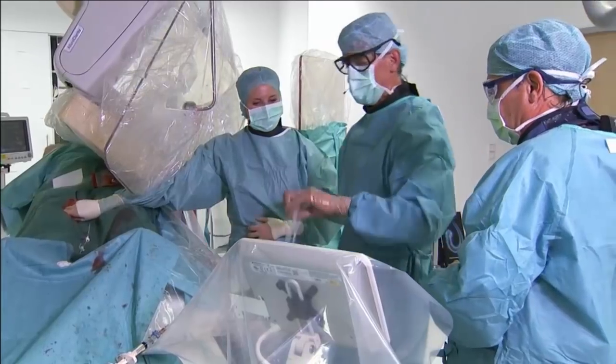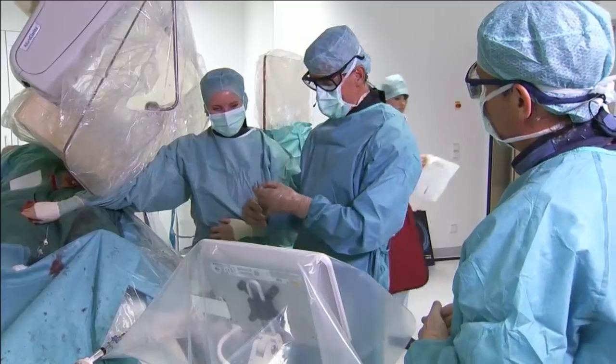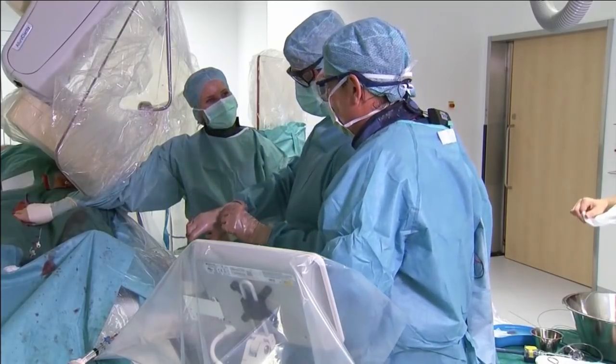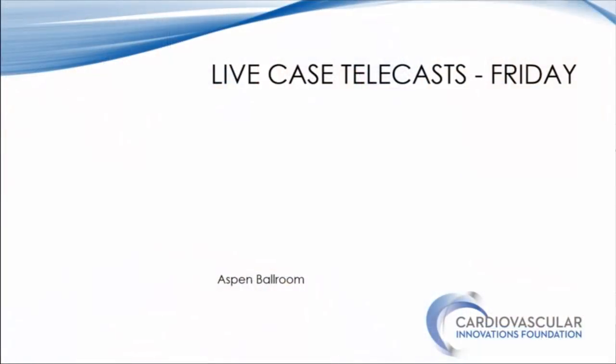I think what was interesting through all these cases is that there are multiple things to learn from Andrej, not just the crossing. Every step and every technique he uses are so clearly deliberated. Mehdi, please. I think the thing that you learn the most about him is that he's so careful and calm, and also takes his time. The first case really highlighted the amount of time he took to pre-dilate and post-dilate. We just don't do it. We've seen a lot of operators, myself included. We want to just do it quickly. So it was really a pleasure always watching him.